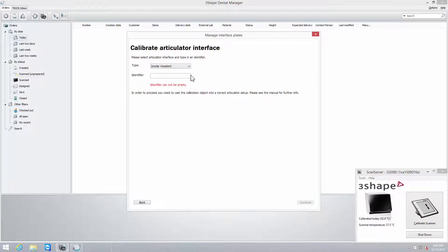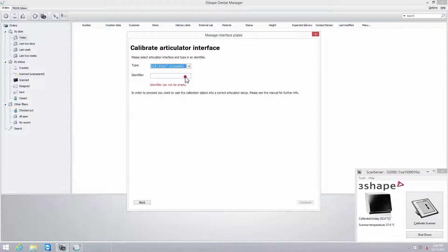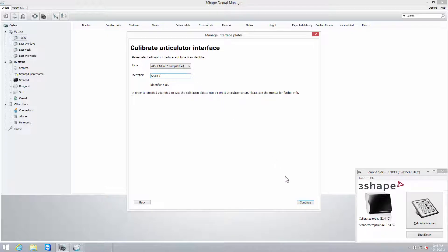In the Type drop-down menu, select your type of articulator and below, fill in its identifier in the provided field. Then press Continue.